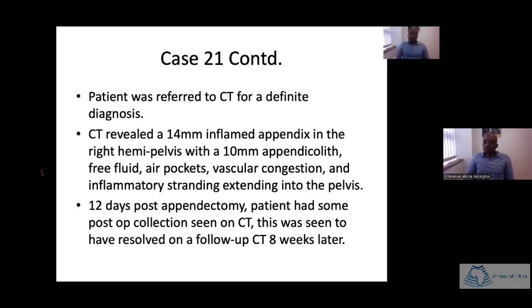CT reviewed the same day showed a 14 millimeter inflamed appendix in the right iliac fossa with a 10 millimeter appendicolith, free fluid, and some vascular congestion, and inflammatory stranding extending into the pelvis.